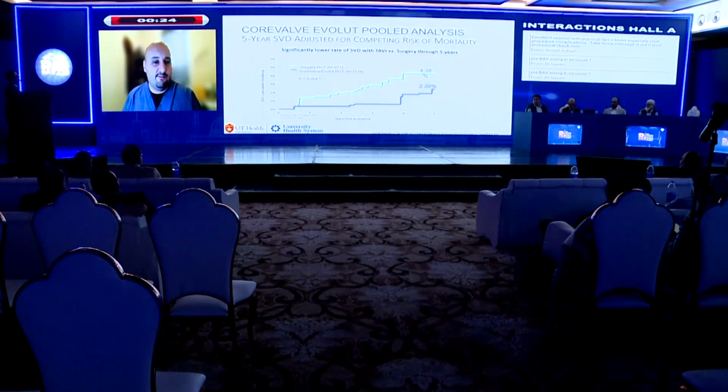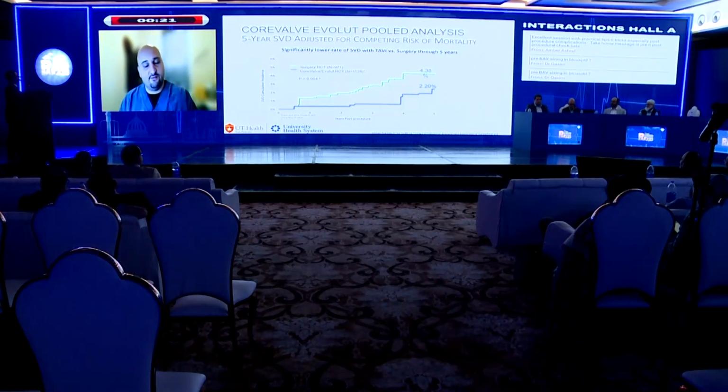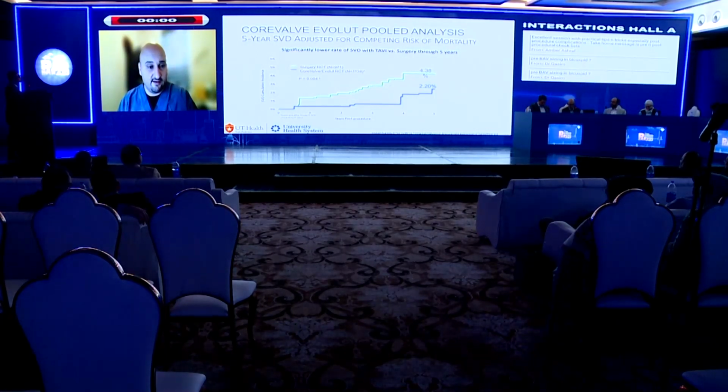Now, what about durability? Especially as we're going into younger and younger populations. We have recent data from a pooled analysis of multiple trials comparing the self-expanding valve to surgical valves, and we did see less structural prosthetic valve deterioration with the CoreValve compared to surgical valves, especially in the small annulus. So this is also great. This will lead us to maybe be more comfortable treating younger patients with this technology.